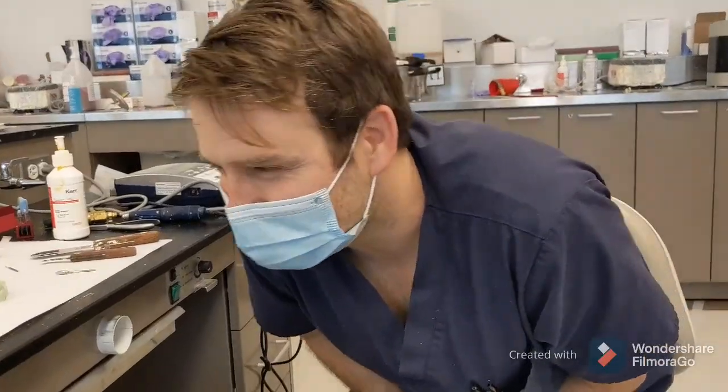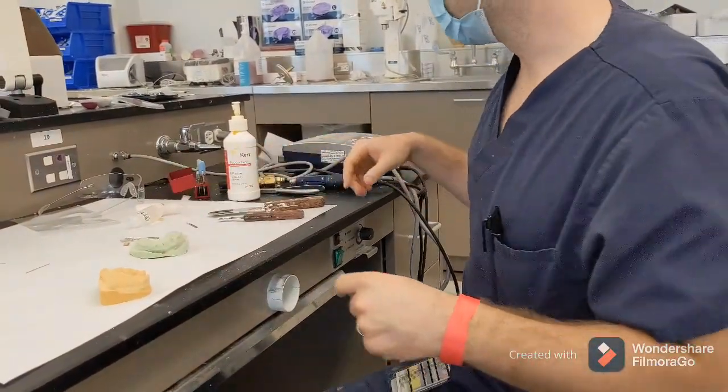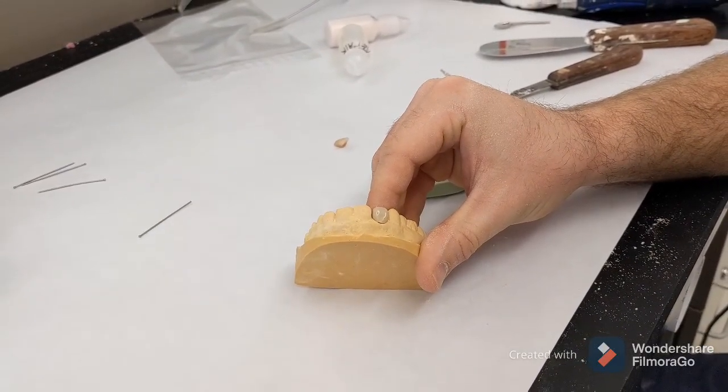Machinist error. So let's get some wax — we'll hold it in place. We'll think about bending our wires now.